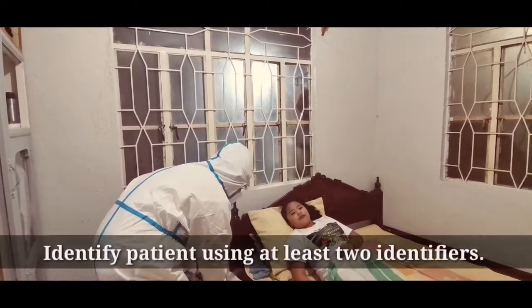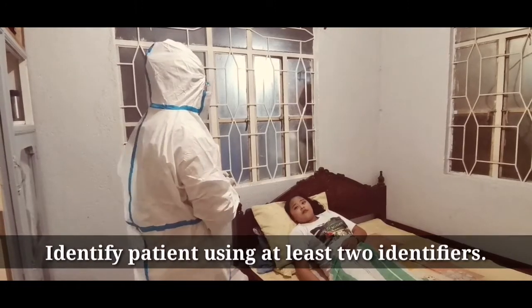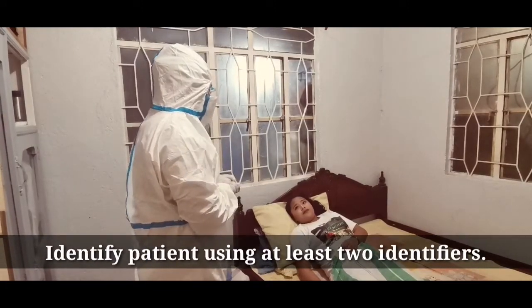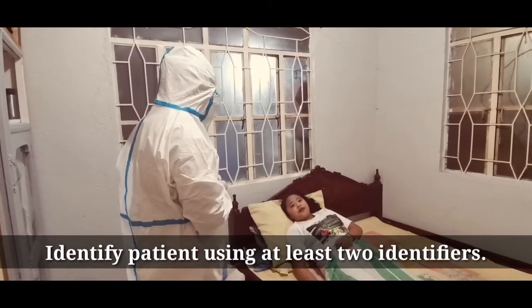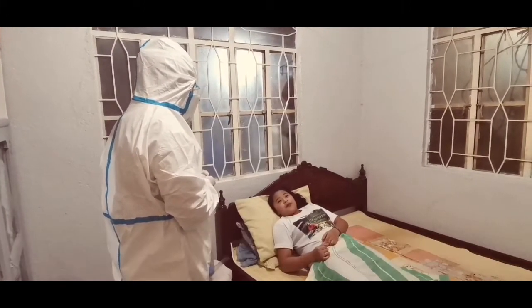Good morning, ma'am. My name is Josamee Miranda from Wisley University, Philippines, your student nurse for today's shift from 7 a.m. to 3 p.m. May I know your name, ma'am, please? Jumayka Mangulabna. Ms. Mangulabna, kailan po ang inyong birthday? June 25.